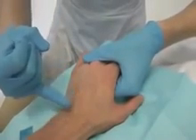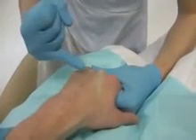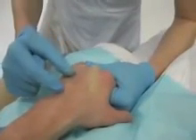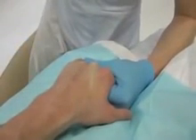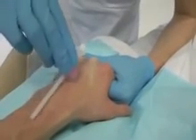Select an appropriate vein. The vein should be as large and as straight as possible. Bend the wrist and pull the skin tight over the knuckle to straighten and anchor the vein. Choose an appropriate entry point. If possible, try to avoid the length of the cannula crossing the joint.